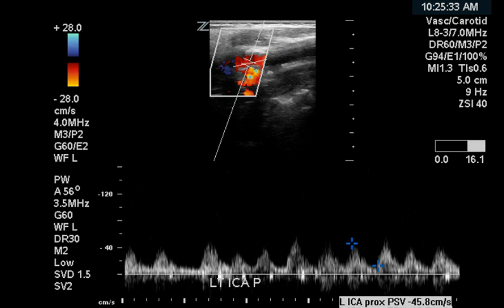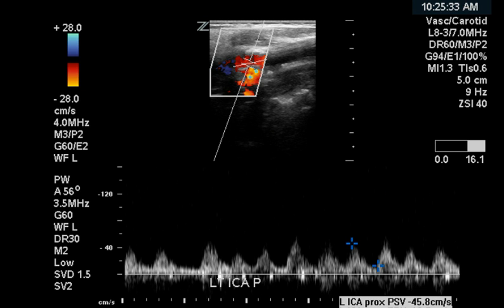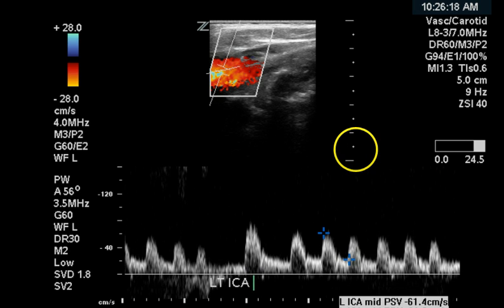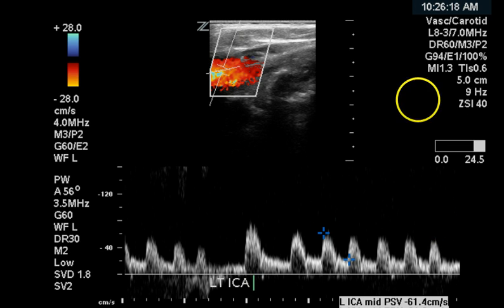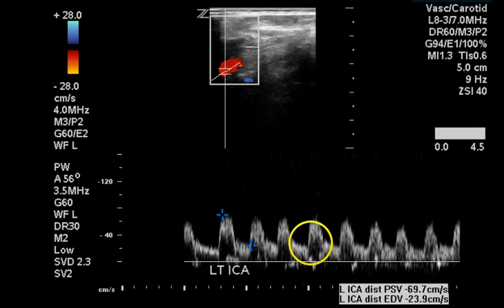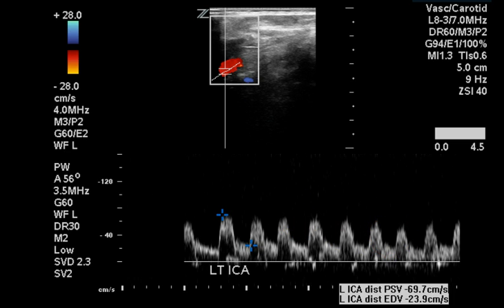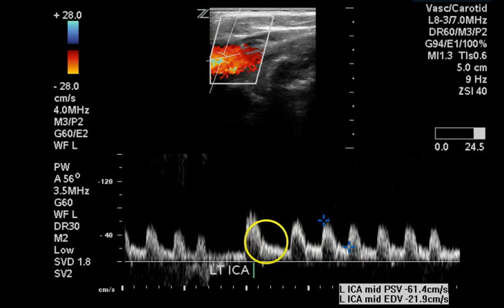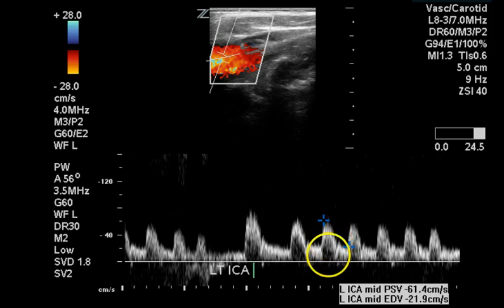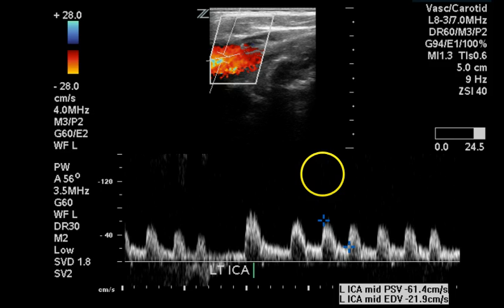The left internal carotid artery gives a peak systolic signal of approximately 45 centimeters per second, which is normal. In the mid ICA, again there are signs of arrhythmia and rapid heart rate, but a nice spectral window, a normal waveform, and normal velocities are demonstrated.